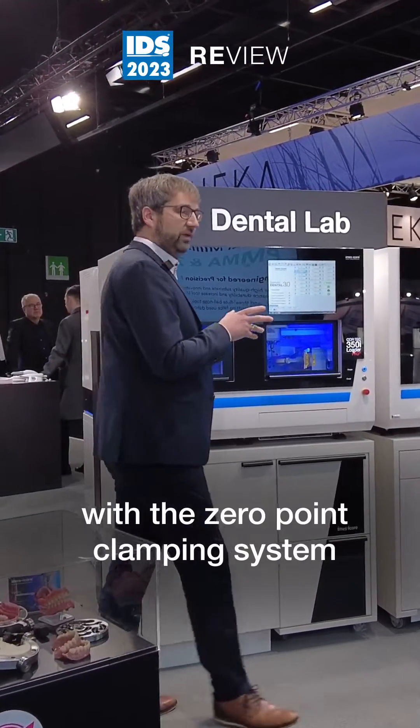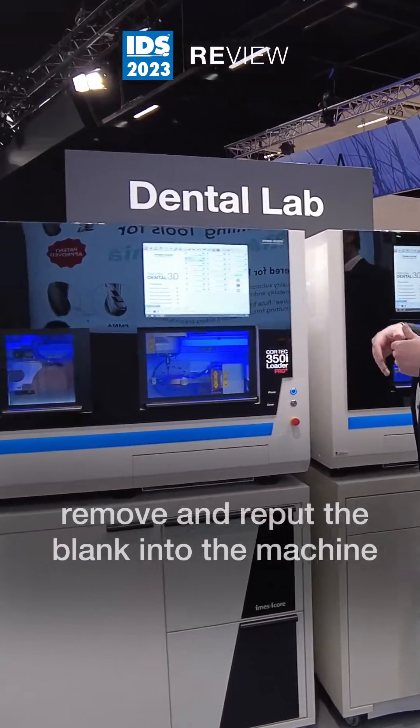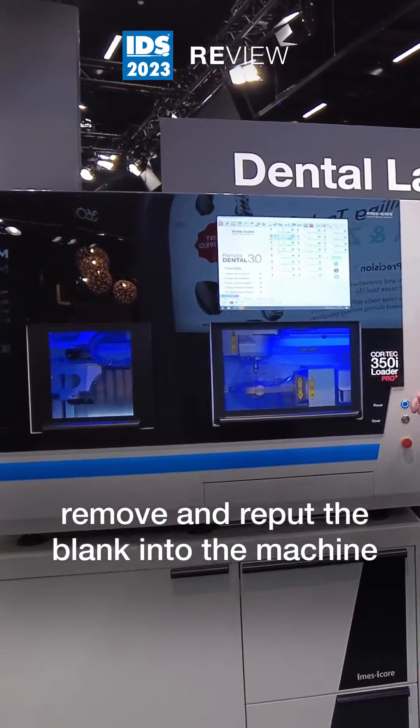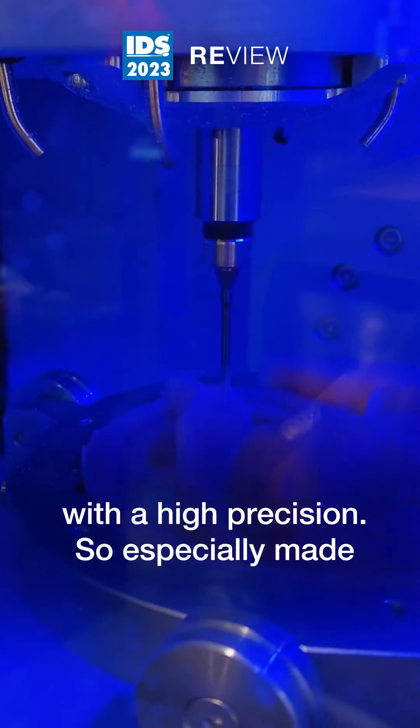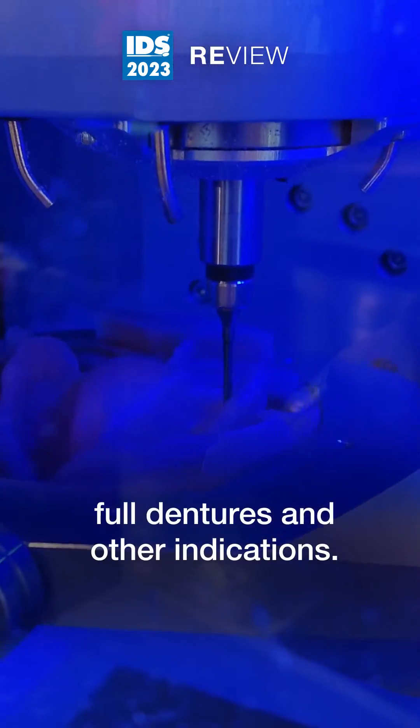All of these machines are equipped with a zero point clamping system that allows you to easily remove and re-put the blank into the machine with high precision, especially made for remilling of telescopic crowns, full dentures, and other indications.